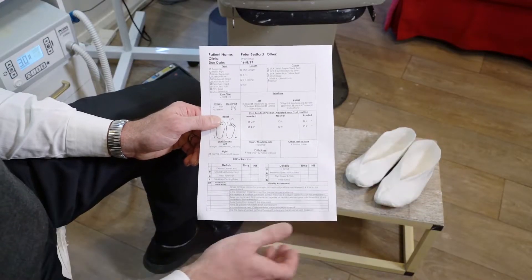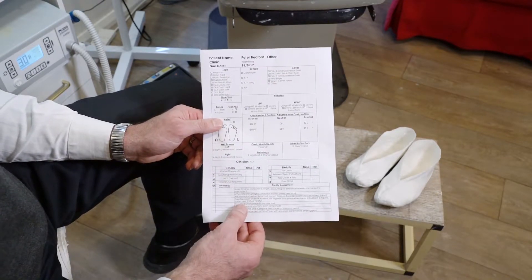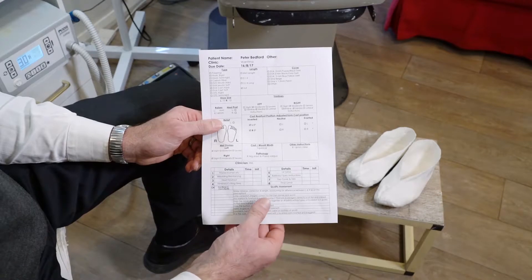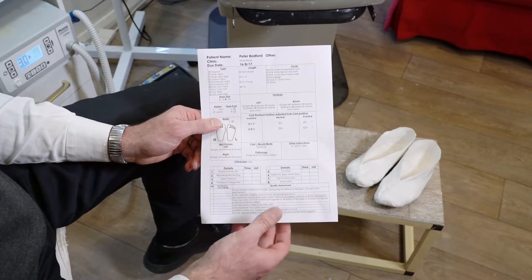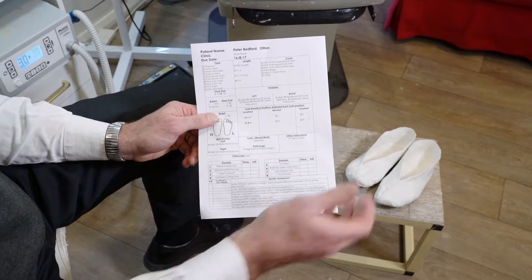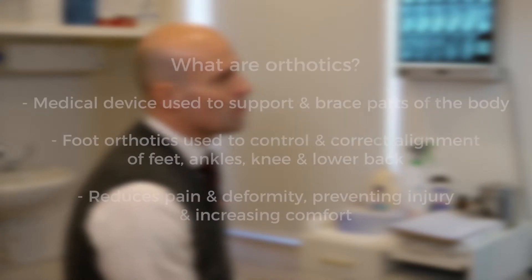Now that we've got our pair of completed casts with three arch technology, I've also made up the prescription for the orthotics. This prescription has the type, length, covers, and specific biomechanical measurements needed to complete the orthotics. At the bottom we have the quality assurance section to ensure top-notch quality every time. This will be sent with the casts to the Complete Feet laboratory for fabrication.